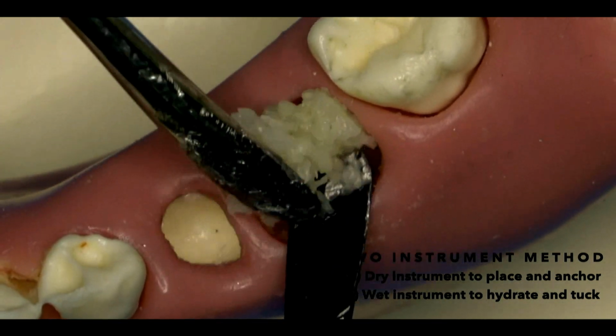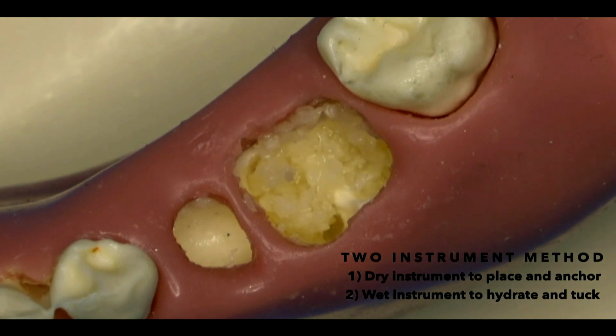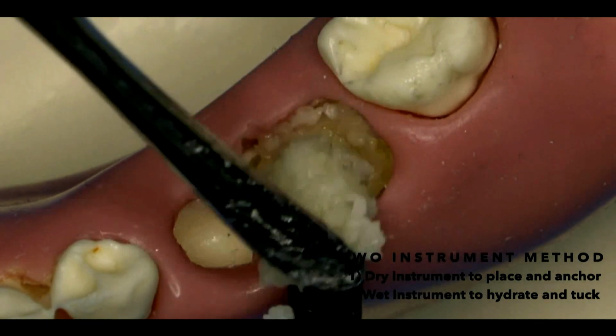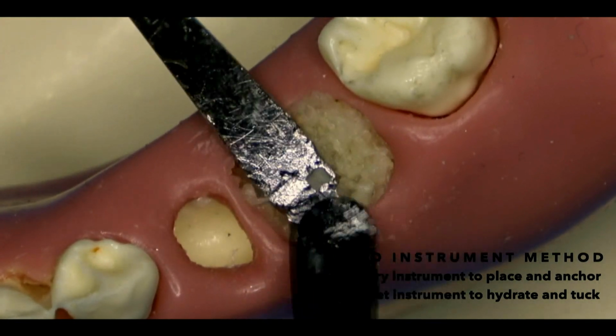Very, very, very important is you want to keep that BioXclude dry. Okay, you want to keep the Amnion-Chorion membrane dry until you're ready to use it. And so we'll pack our socket, and then we will use what we like to call the 2-instrument technique.